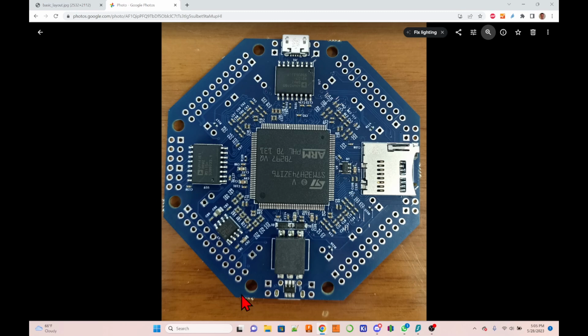And then I think you only need pin headers on those 4 positions, but while you're at it, I would say just solder all of the positions that there are. If you count them, 1, 2, 3, 4, 5, 6, 7, 8, 9, 10, 11 locations where there is a position for 2 pin headers. And in each of those positions, you want to solder a pin header that on one side has female and on the other side has the long pins, the male pins. And then you solder them in the same orientation on every board. And then they piggyback on top of each other.